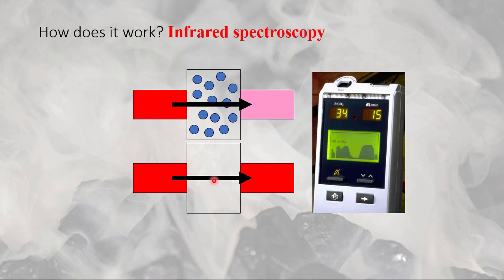Then when the patient exhales, the flow of air reverses and they're pushing CO2 back out through the tube. End-Tidal CO2 measures the CO2 and estimates the pressure, in millimeters of mercury, and that's where you get your waveform. This waveform shows the increase, and that plateaus until you take another breath in. Does that make sense?